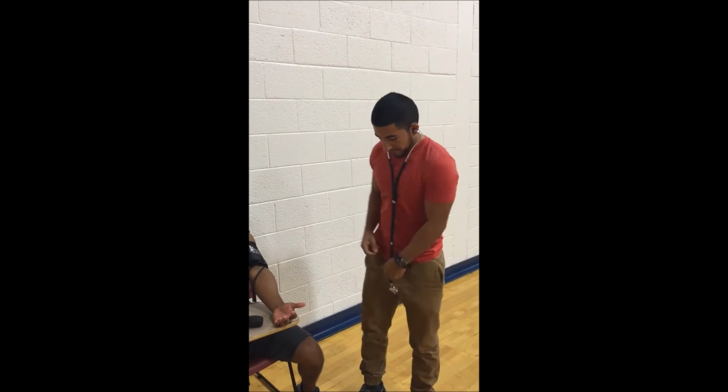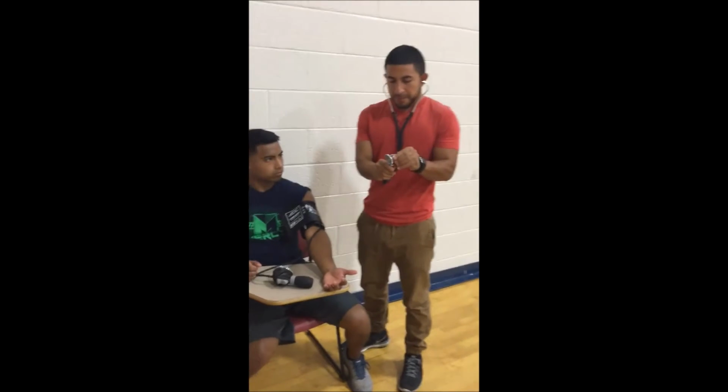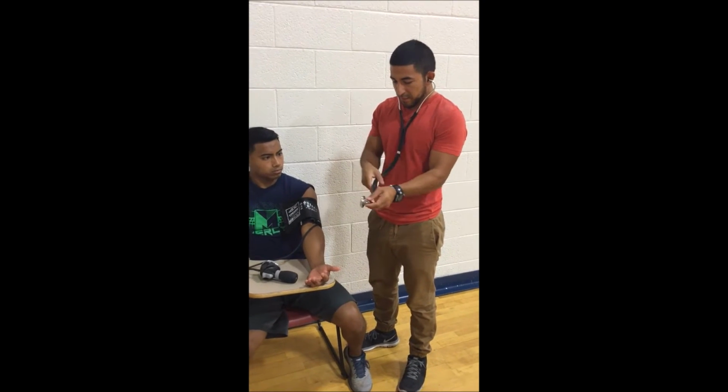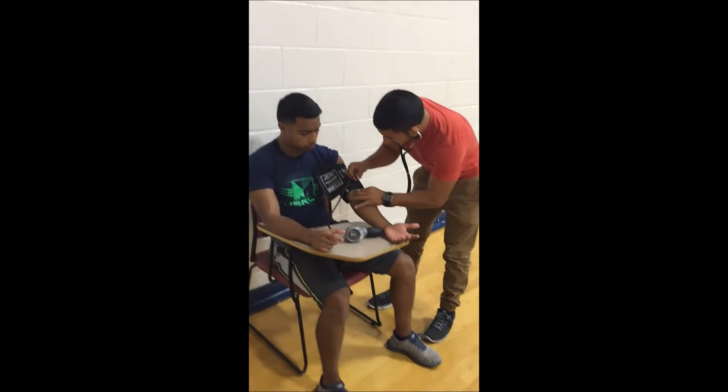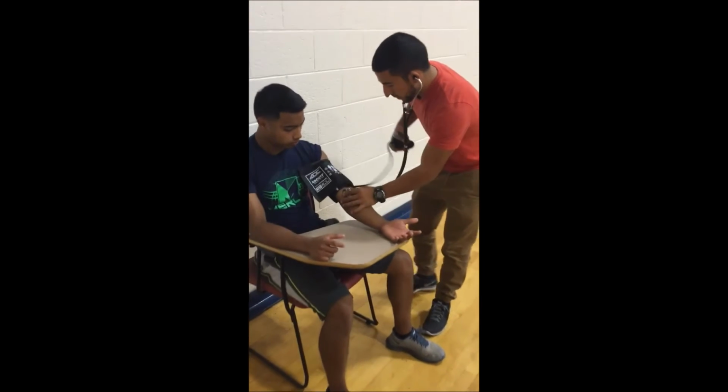When using the stethoscope, make sure that the prongs are facing forward. To ensure the stethoscope is working, twist the top and lightly tap the diaphragm until you can hear clearly. Place the chest piece below the antecubital space over the brachial artery.